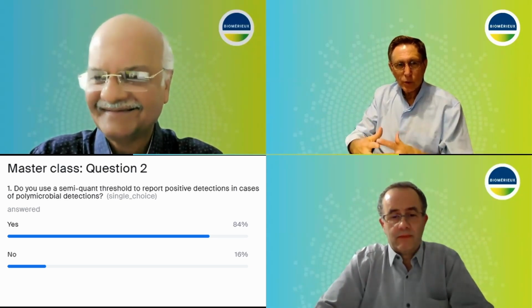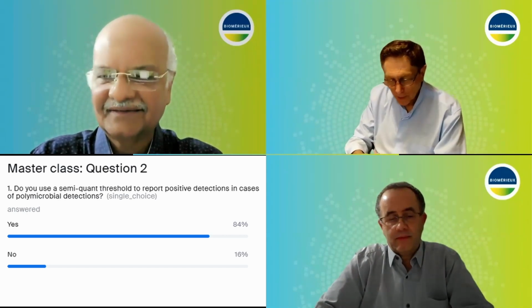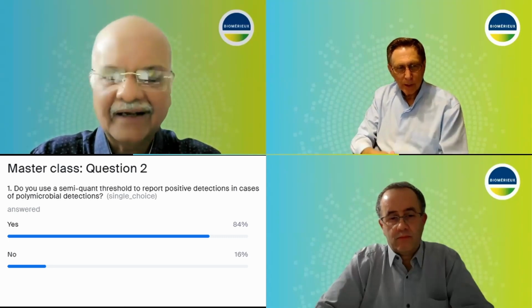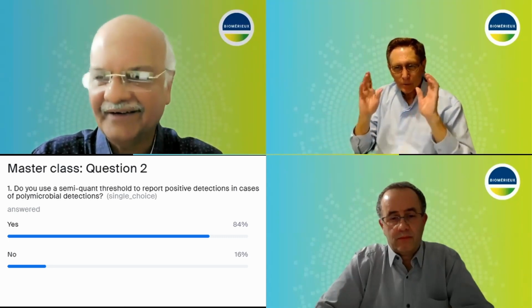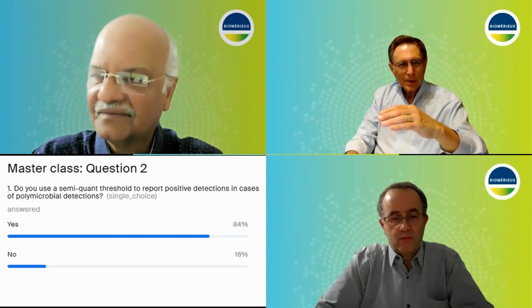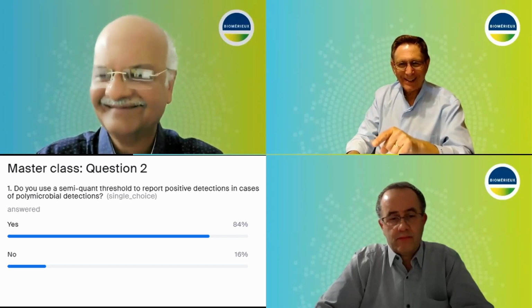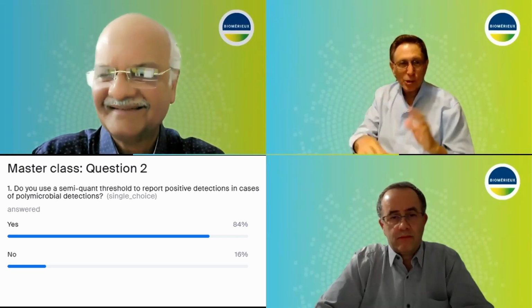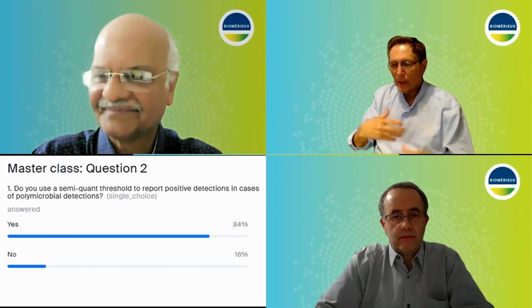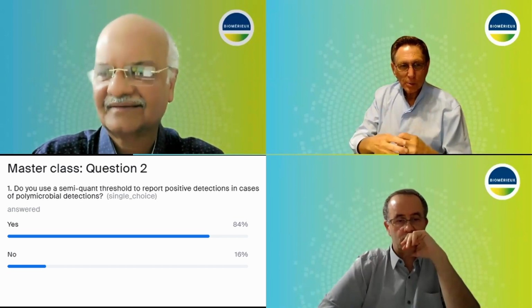And what really is confusing, and I'm sure this is the case for most of you on this call, is that you'll see the gram stain, and it'll say you see a few gram-positive cocci, and then the culture says many gram-negative rods. We see this all the time. And how do you interpret that? I think that's when things get a little bit more difficult.